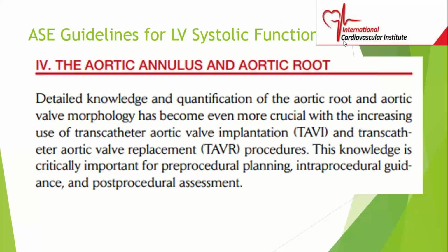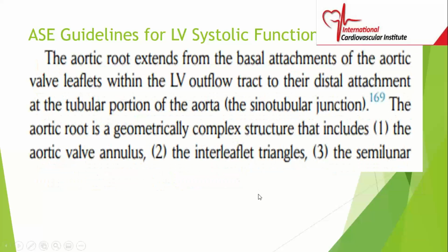doing. We do transcatheter aortic valve implantation, the so-called TAVI, and transcatheter aortic valve replacement, the so-called TAVR. Those procedures require us to have a very close look at the aortic root and the aortic annulus and do an accurate assessment of them. So we're going to spend a little time.